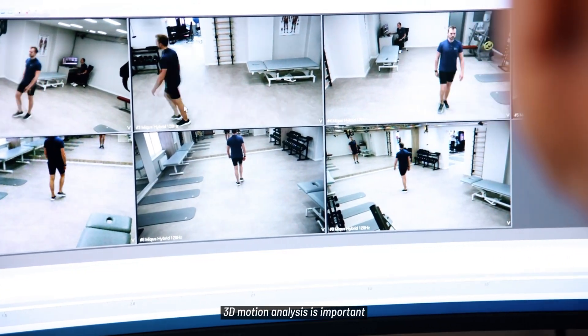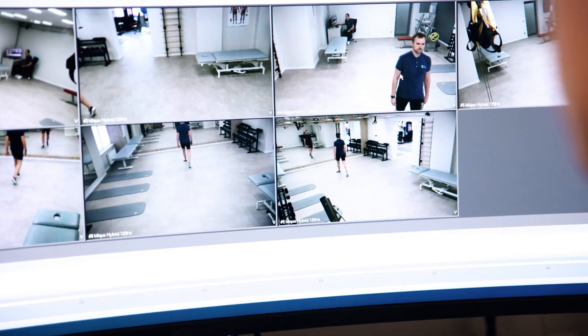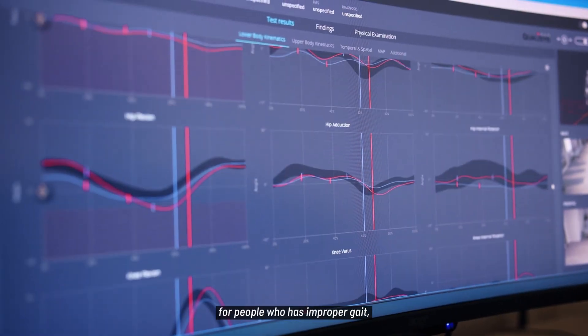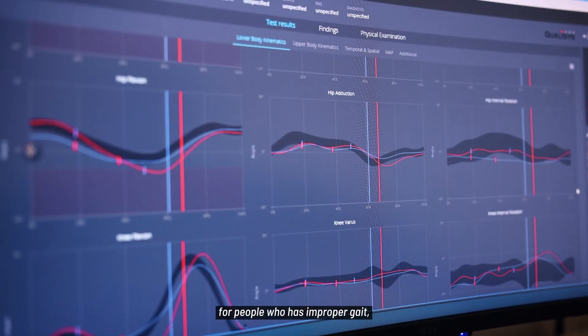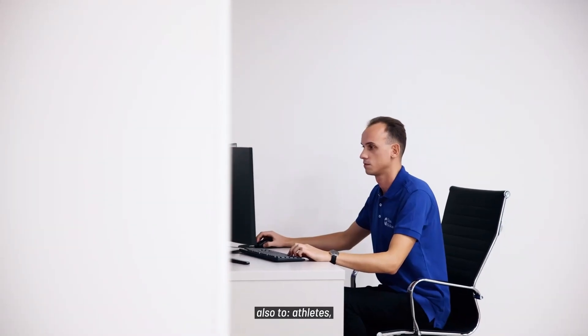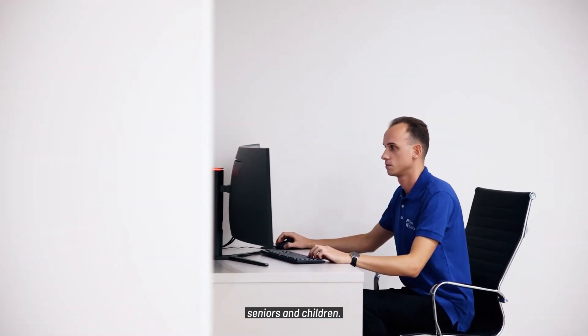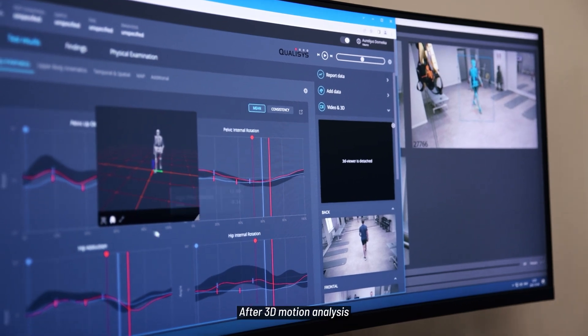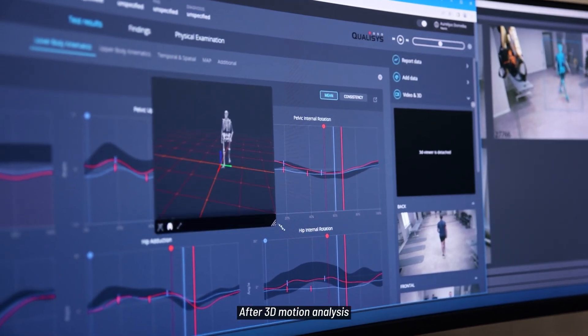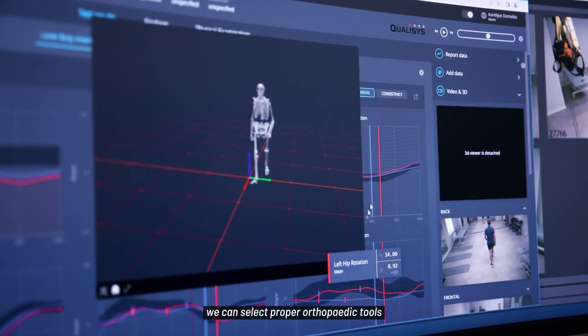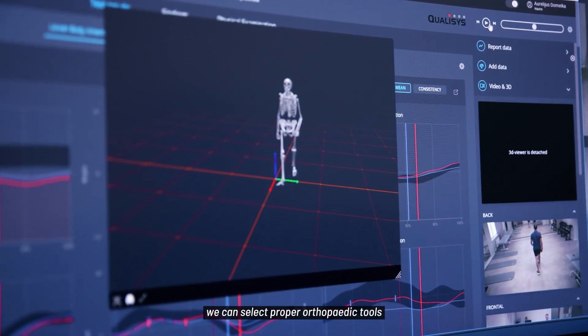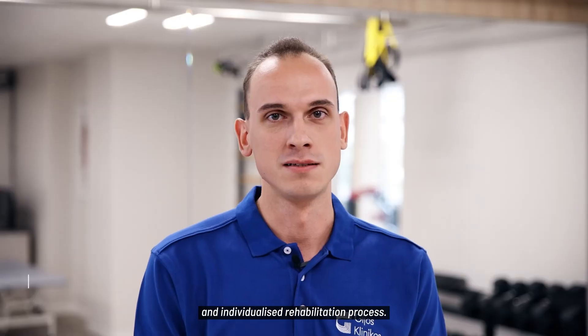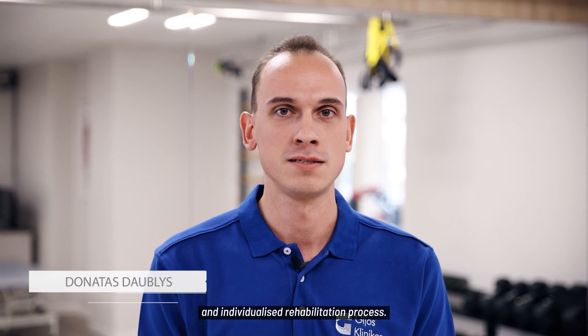3D motion analysis is important for people who have improper gait, also to athletes, seniors and children. After 3D motion analysis we can select proper orthopedic tools and individualize the rehabilitation process.